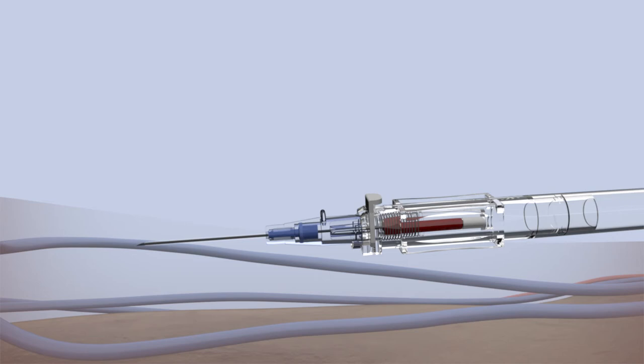Once the catheter has been fully set in the vein, stabilize the catheter body with your non-dominant hand while applying digital pressure on the vein.